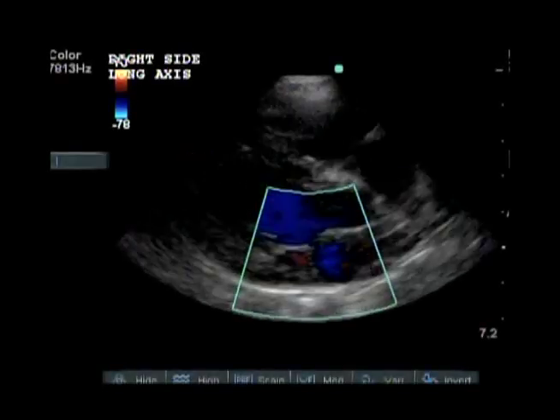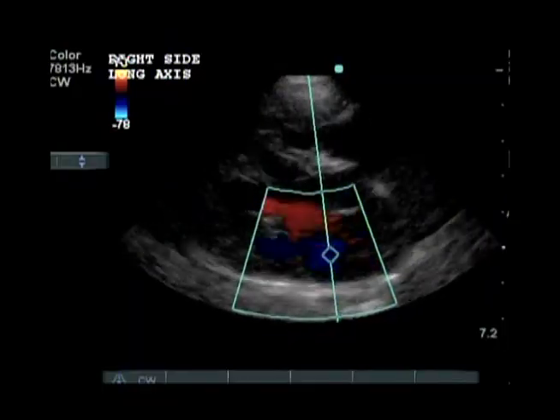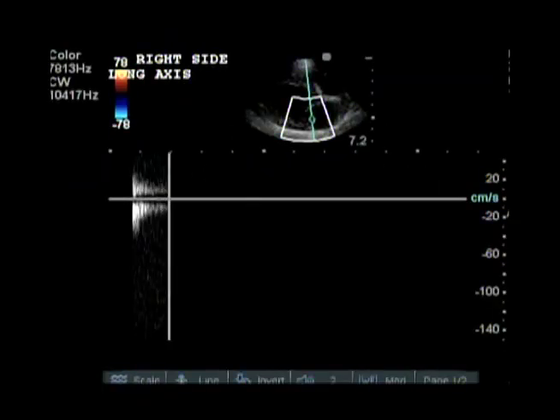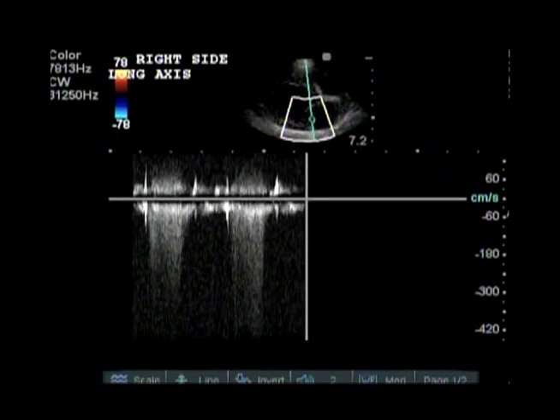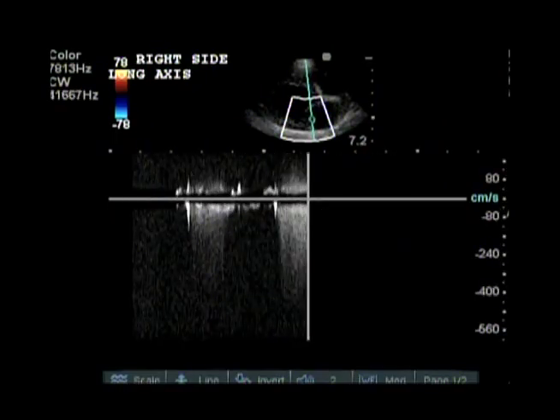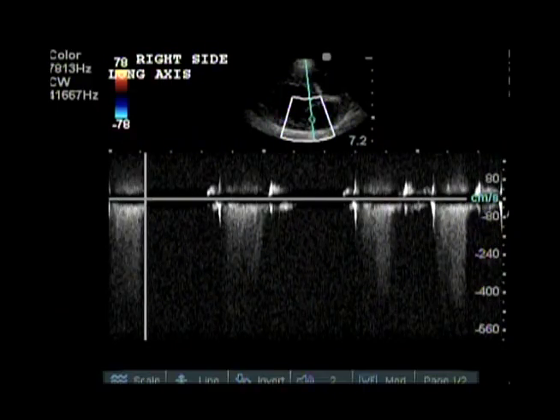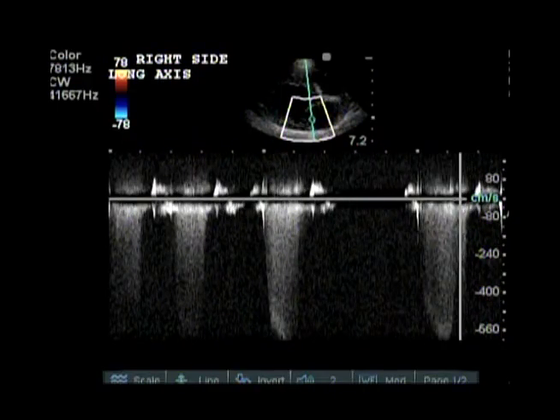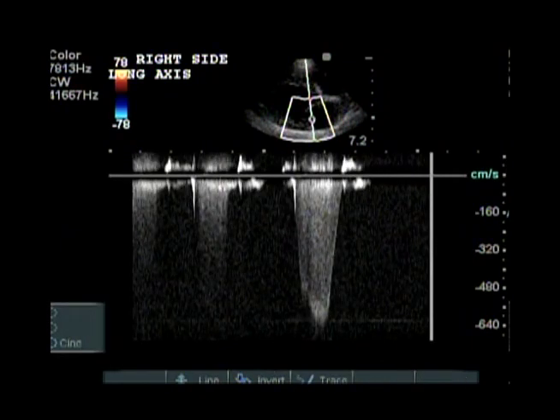To show a well-delineated waveform of a valvular insufficiency or lesion, the spectral Doppler cursor must be in the direct flow of the lesion. If the actual valvular lesion flow deviates from the cursor line, the very peak of the waveform is often washed out or a faded gray.